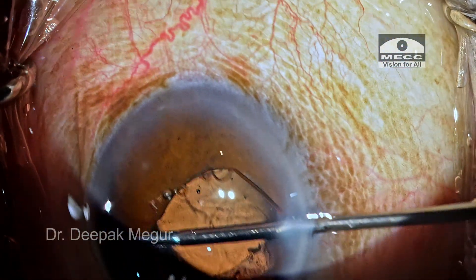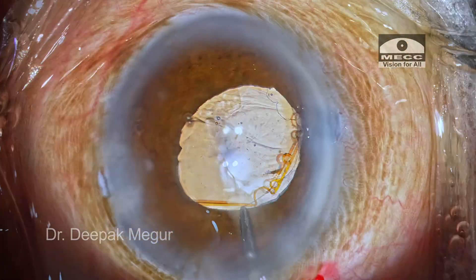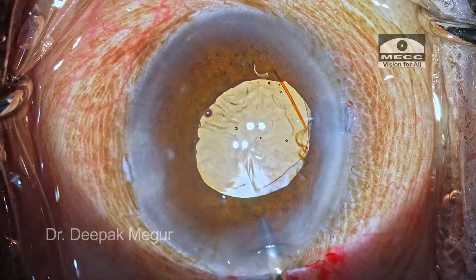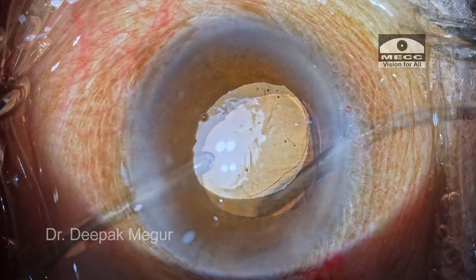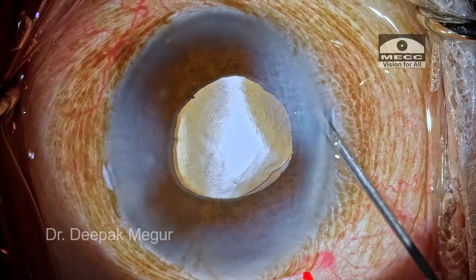The notches are disengaged from the pupillary margin, held with forceps, and pulled out. The OVD both in front of and behind the lens is aspirated out. That's it — the case is done.